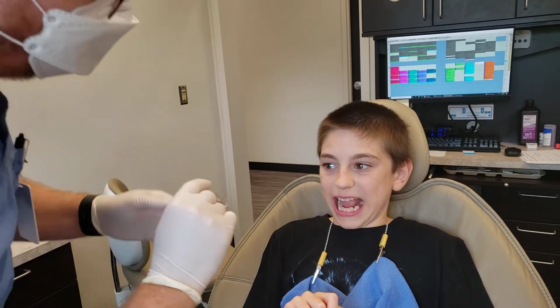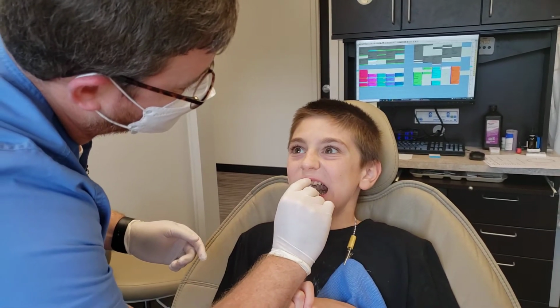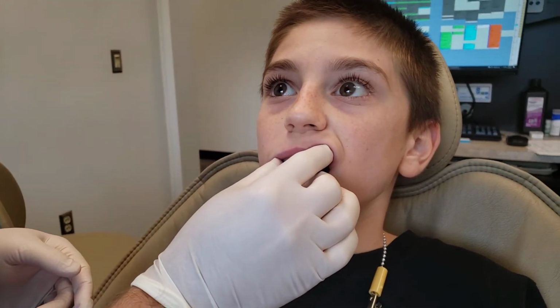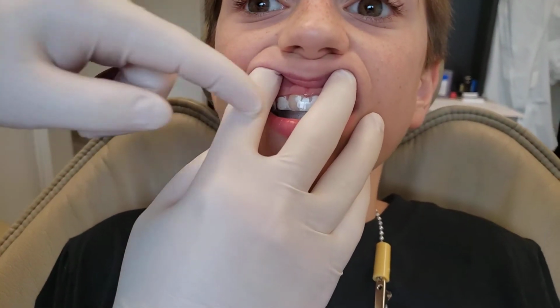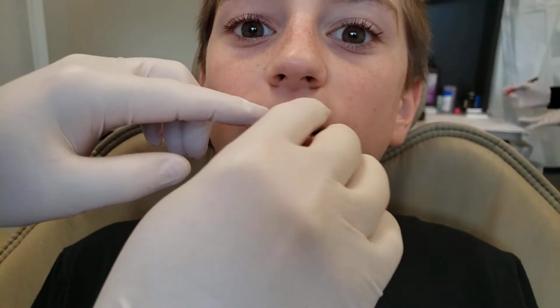All right, so open wide. So I'm gonna have to put my finger right here, and then see how I'm touching your gum right there. All right, now close your teeth together and just kind of hold that in place for me. All right, you see how that little divot lines up right with the middle of his gum? That's exactly what we want. So when this is in your mouth, I want you to keep your teeth inside it, okay?